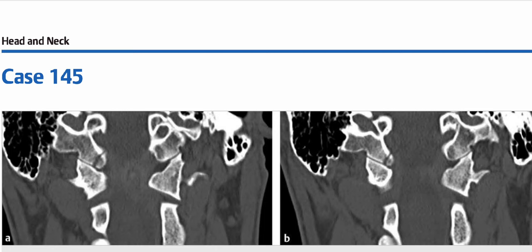Type 1 occipital condyle fracture refers to a comminuted impaction fracture with no or minimal displacement of the fracture fragments. Type 2 occipital condyle fracture consists of a basilar skull base fracture that extends into one or both occipital condyles. This is a case of type 1 occipital condyle fracture.